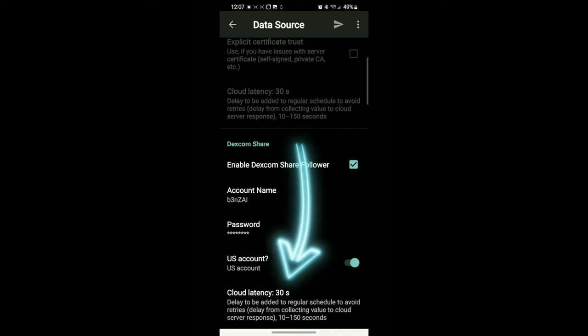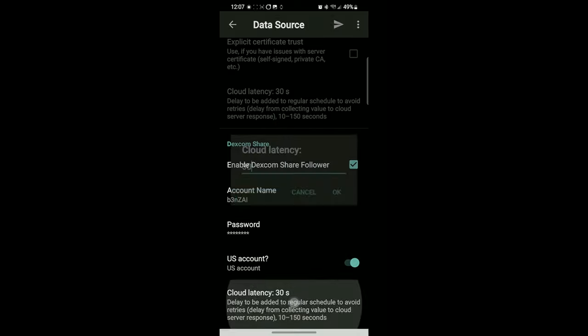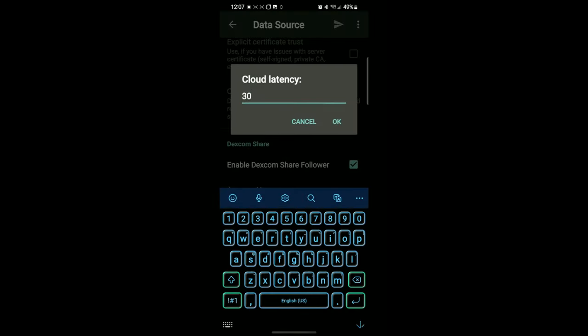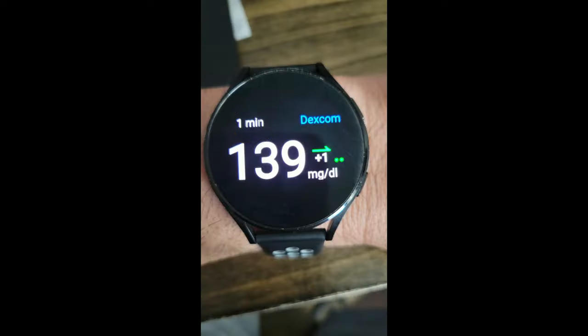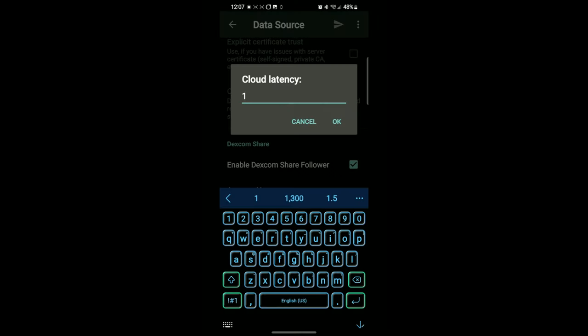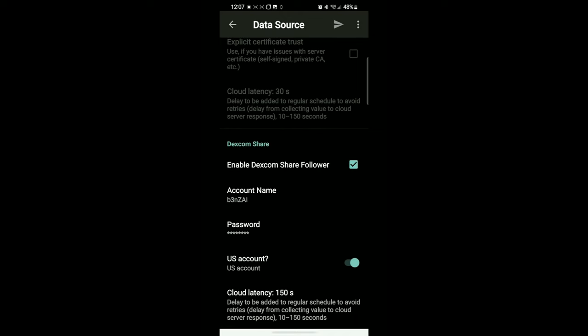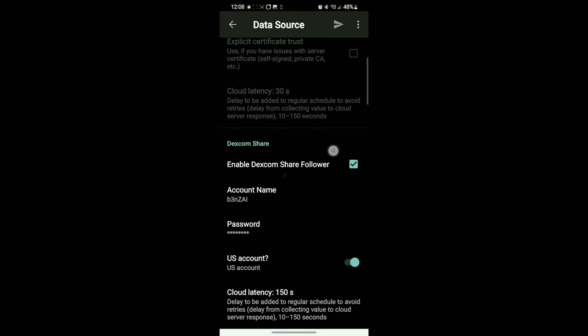After a lot of these steps, you're going to want to refresh or send the values. I try to do this as often as possible when I'm setting something up. Make sure you change it to a US account. And cloud latency, that's how often this app is going to update for you. You see here one minute ago it updated to 139, that was my milligrams per deciliter. So I'm going to set this to 150 seconds that way it doesn't drain too much of my battery.